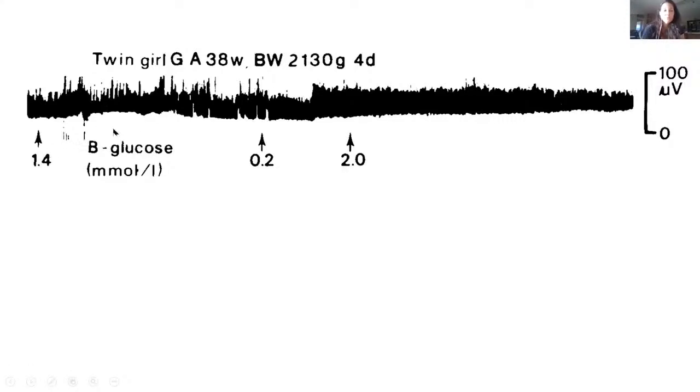The value was 1.4 and dropped to 0.2 on very low values. And you can see here these little uprisings, potentially seizures, difficult to know unless we see it. But here, look at this amazing increase. And you can see the bottom margin moving upwards. And this is all after the blood glucose had been corrected.